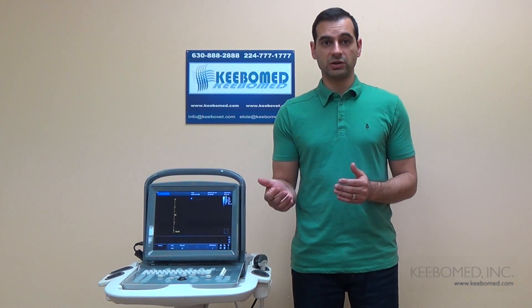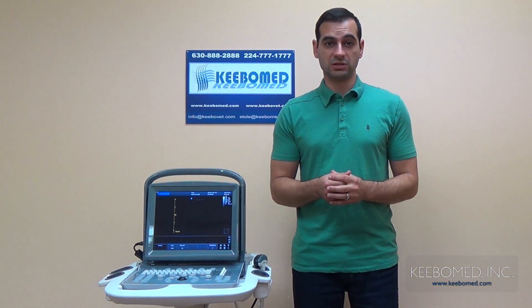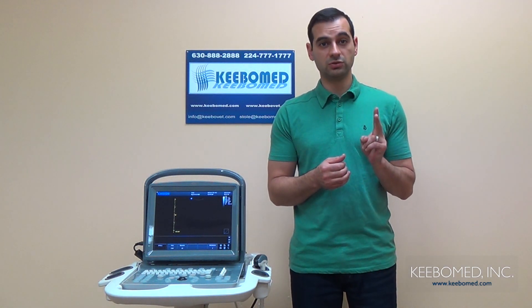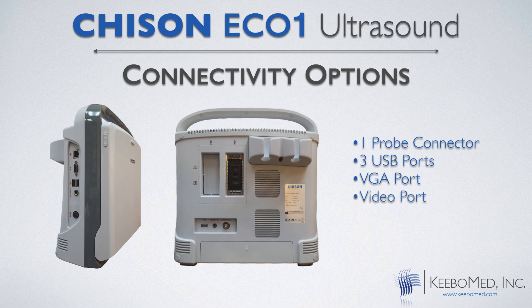The Eco1 also has very good connectivity options. It comes standard with one probe connector, although two probe connectors is optional. It has three USB ports, whereas most ultrasounds have either one or two USB ports. Some of the other ports include VGA, video port, LAN port, and also a DICOM port is an available option.